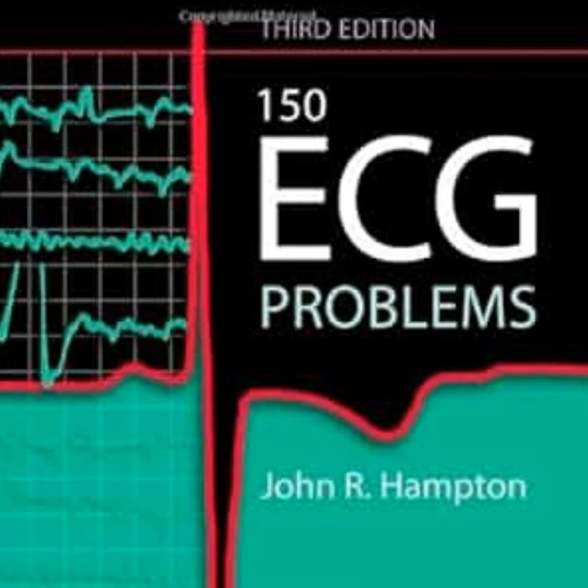Right. So let's test that rule with a scenario that pretty much every clinician dreads. Okay, let's hear it. A patient presents to the emergency department, and they have a highly convincing history of an acute myocardial infarction. The classic presentation. Right. They have that heavy radiating ischemic pain. They're sweating, diaphoresis, the whole clinical picture. Okay. You run the ECG in that first hour, and it is completely pristine. I mean, normal sinus rhythm, no ST segment deviation, completely normal T waves. So it looks perfect on paper.